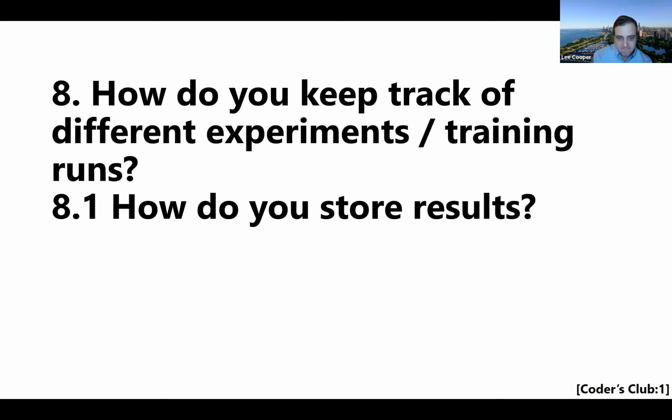Yeah. I think version control is a good option, because if you script out all of those things, then you could say, okay, we got these results with this Git hash. And so then you can check out exactly that set of code and run it again if you need to. But again, that requires discipline, right? You got to commit your code, make sure that it works, make sure that somebody else can use it, right?